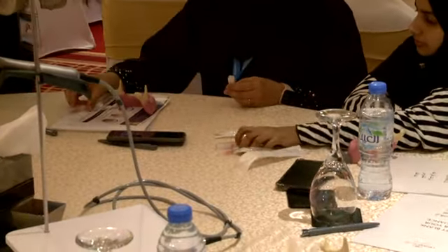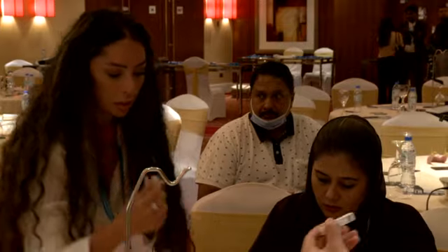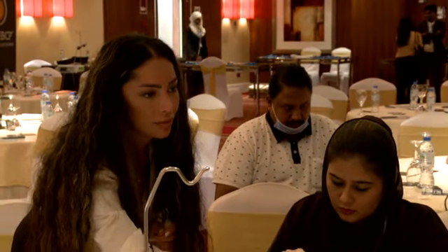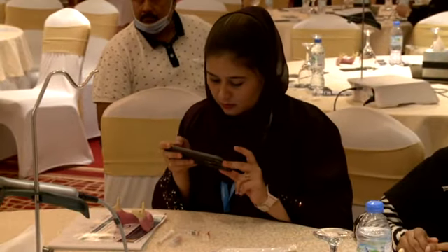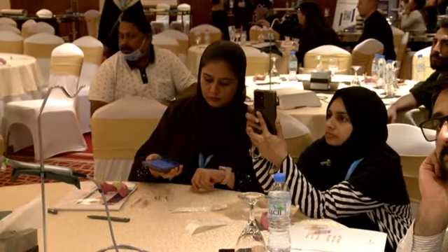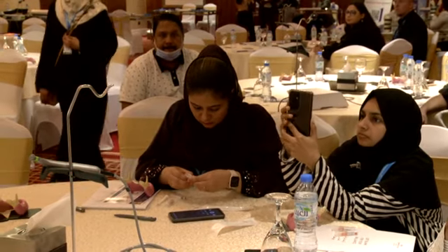So it's only one drill protocol. What you have in here is the drill itself with different diameters and lengths. As normal, you will have 6, 8, 10, 12, 14, 16 millimeters. Ultimately, for this practice, it doesn't matter because you don't have to look into the type of implant you're going to be placing.